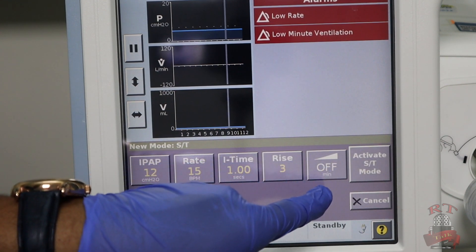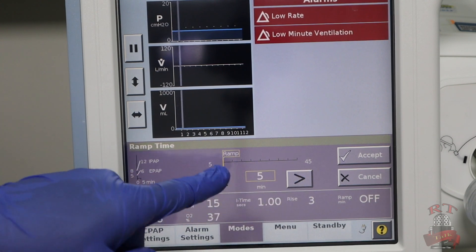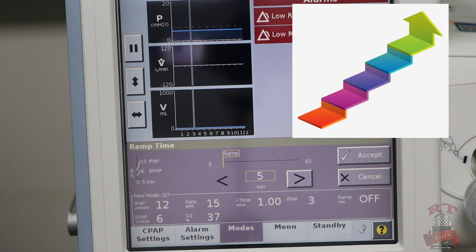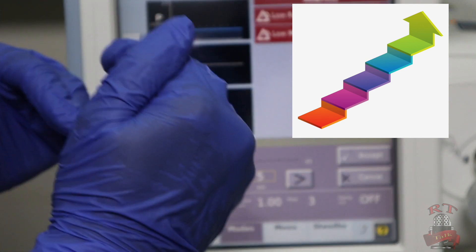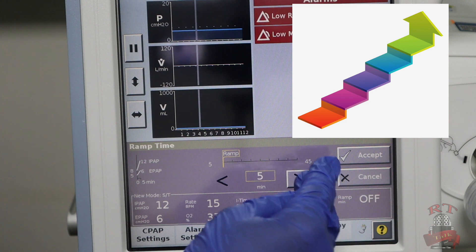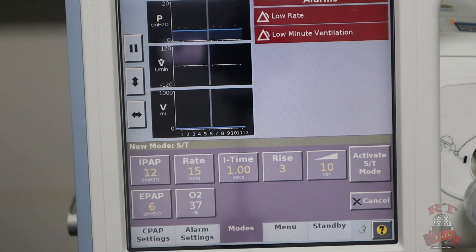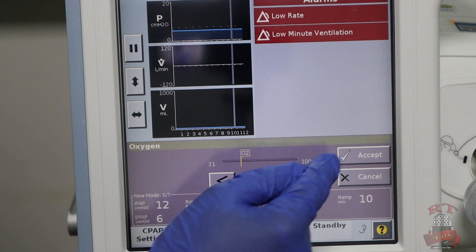Then the last thing here is the ramp time. As we said, do you want to start your settings, the IPAP and EPAP, directly when you put it on the patient? Or do you want to set your settings, put the mask on the patient, and your settings will go automatically, gradually up? For me, after 10 minutes. Your percentage of oxygen—I want it at 40. Accept.